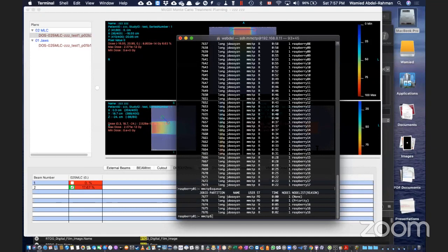Another problem is converting. I had problems converting any image to, for example, do a calculation in water. I did not know whether the problem was in the image itself, or in generating those voxel conversions. Now I understand how to look into this. So I could not actually confirm whether there was a problem. Maybe the problem was me. We need to do it again. If you do have a structure, there's an option to fill that structure with a specific density and material. True. I tried that, but there was something wrong. I have to try it again, and probably it's going to work this time.